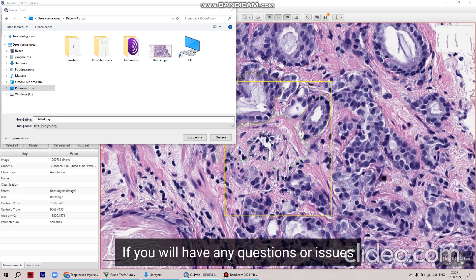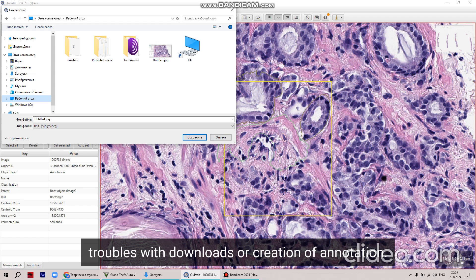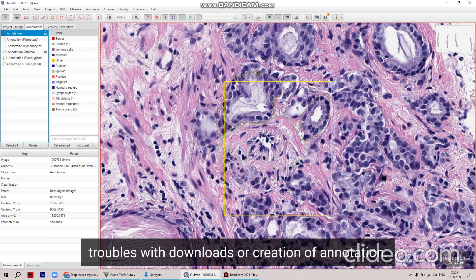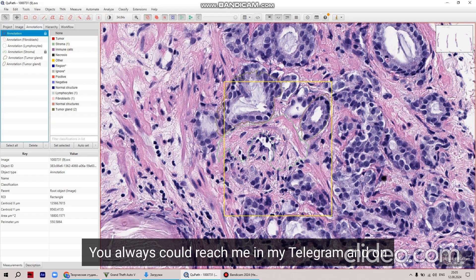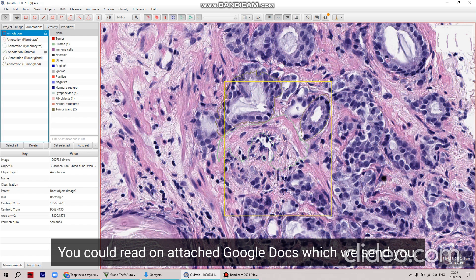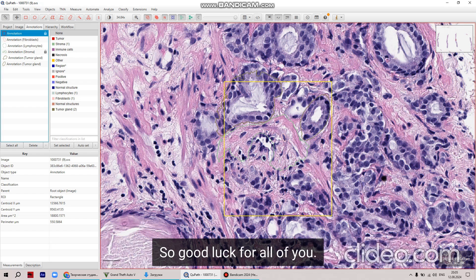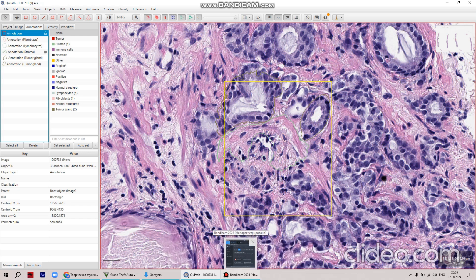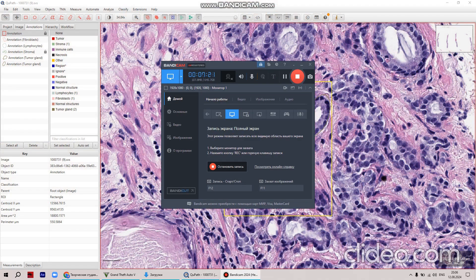You then create the annotation. When you complete it, you have to set a class. If you want to correct a line from the external side of the image, hold Alt to correct the line. Then click the right mouse button and set the classification type. You also have to add your own label name — click 'Add Class' and select your label name.